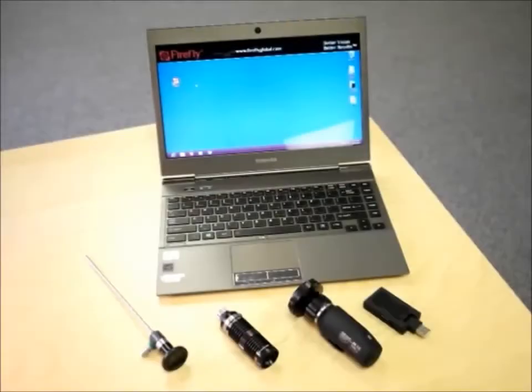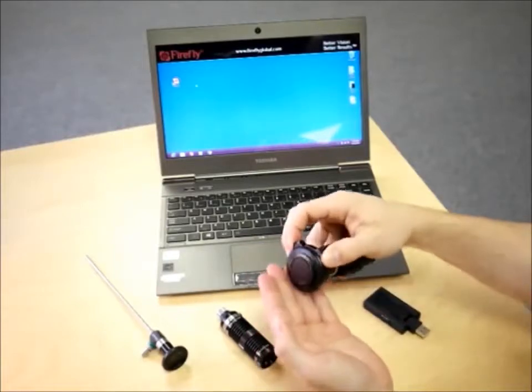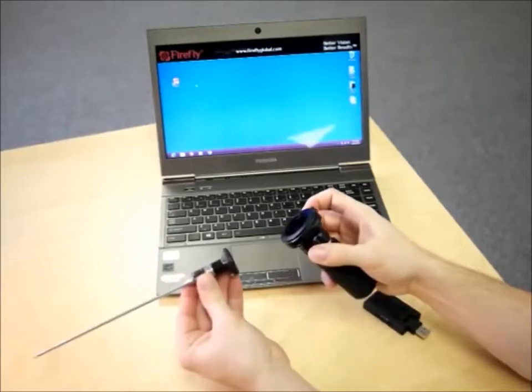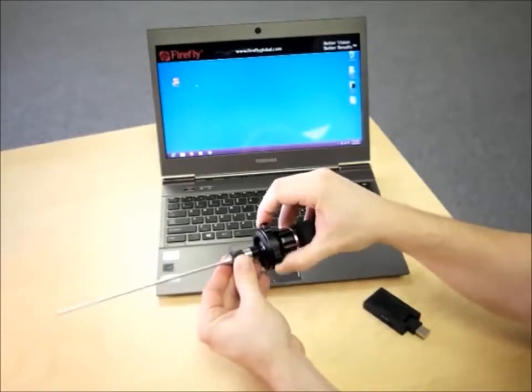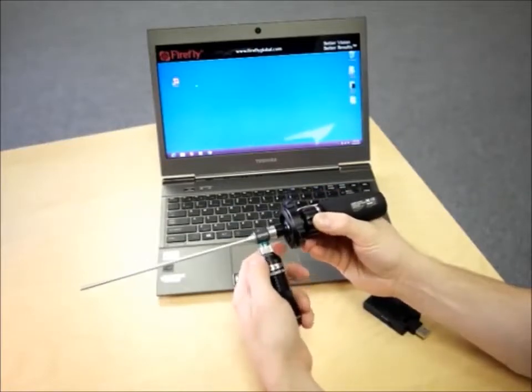To use the Firefly, first squeeze the connector tabs together on the universal coupler to remove the protective cap. Squeeze the tabs together again to attach an endoscope to the coupler. Connect your light source to the endoscope to complete camera setup.